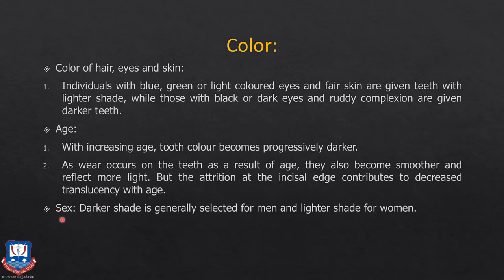The sex also again will determine. For males we generally tend to use a darker shade, whereas for females we prefer to give them lighter shades, because it is a general preference of theirs also.